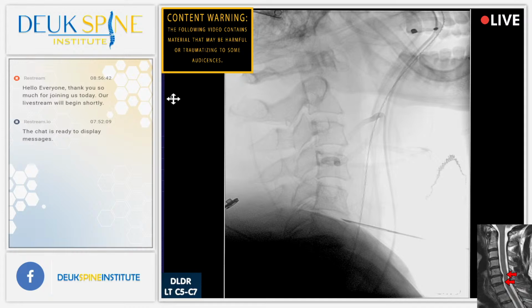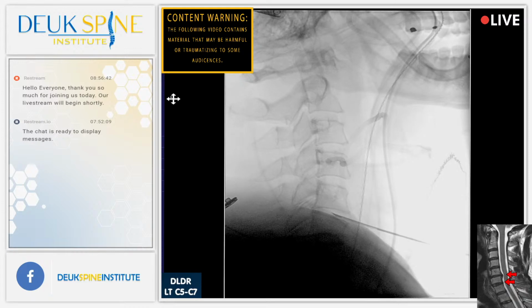All right, Jordan, count for us. C2 down. So C2, 3, 4, 5, 6. And that's the 5-6 disc that we're at. Everyone agree? All right. So I'm going to advance my spinal needle into the disc. Shot. I'm through the annulus. I'm in the middle. And at this point, we're going to do what's called a discogram.